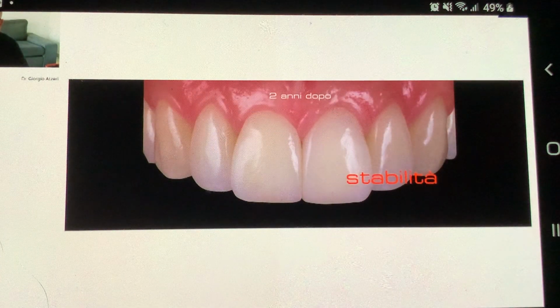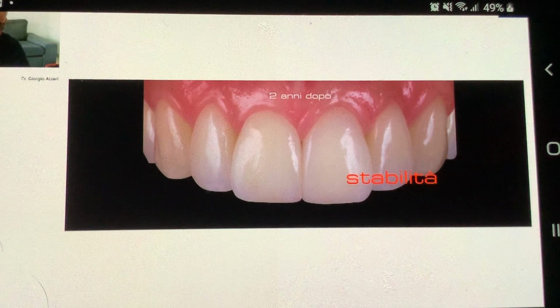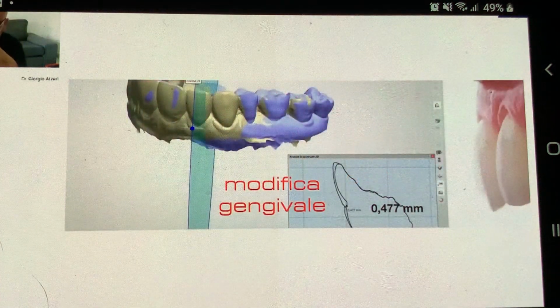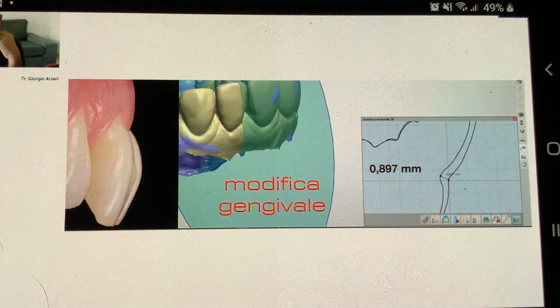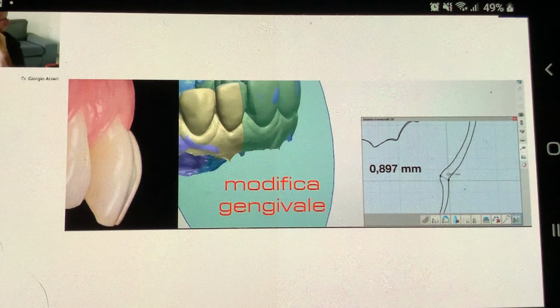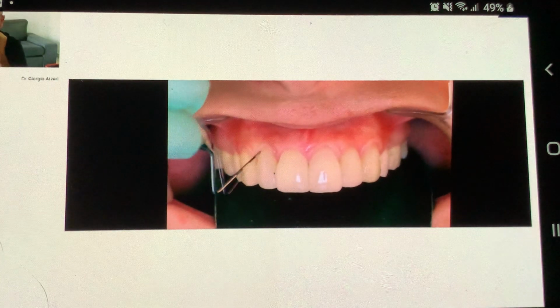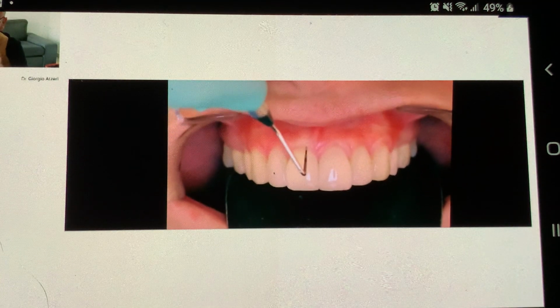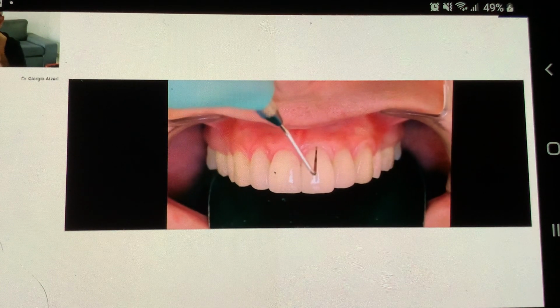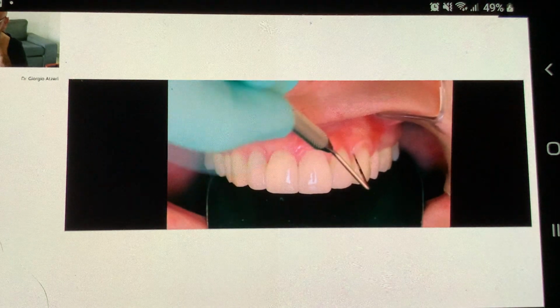We can only use the shape, and through the shape we induce a displacement, a change in the volume, which is measurable through scans. So depending on the section, we have extreme increments, in this case from 0.4 to 0.9. And this is not related to the gingival inflammation, because these gums, even when probing intensely, don't bleed, and there is no type of problem.